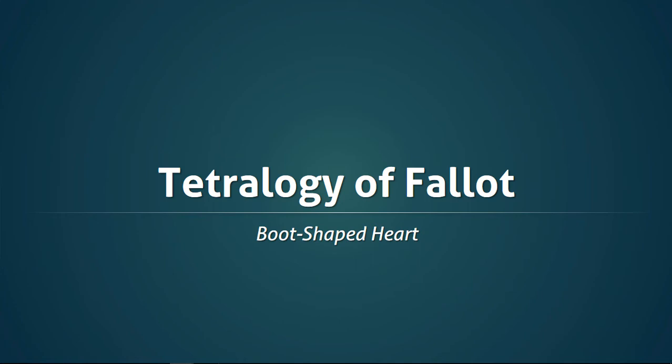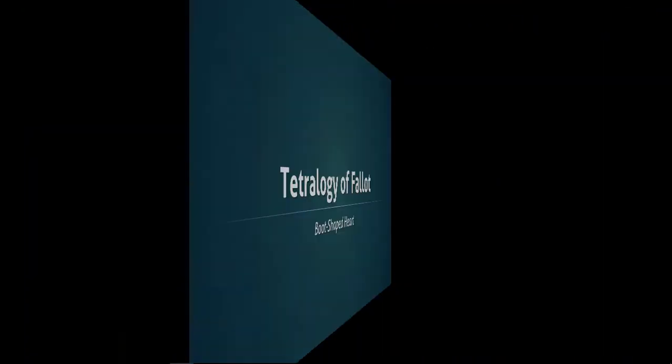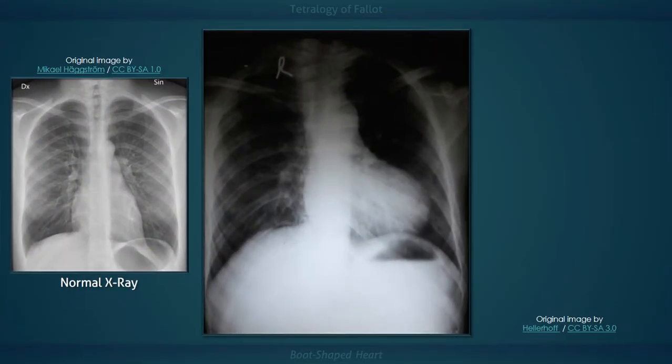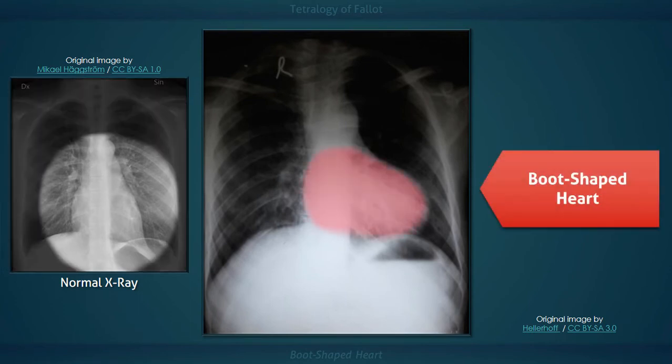This lecture will discuss the potential radiographic findings in a chest x-ray taken from a patient with tetralogy of Fallot. The term boot-shaped heart refers to the abnormal appearance of the cardiac silhouette. Two of the four classic defects that contribute to this appearance are a ventricular septal defect and pulmonic stenosis.